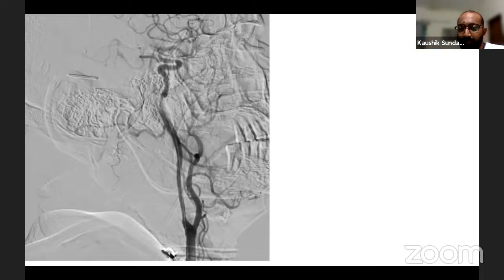Supposing I'm going to do a angioplasty and I know this carotid lesion has been chronically occluded and the collaterals are good, I'm worried about reperfusion injury. So I will say, let us do it under GA and keep the BP low for the first 24 hours so that there is no reperfusion injury. So it's like a Venn diagram, not a Venn diagram, what do you call it? It's like a map. The moment you see this, you should start planning your case.